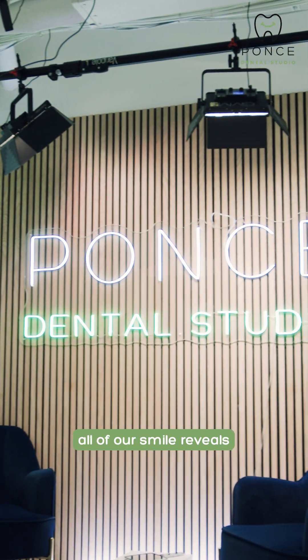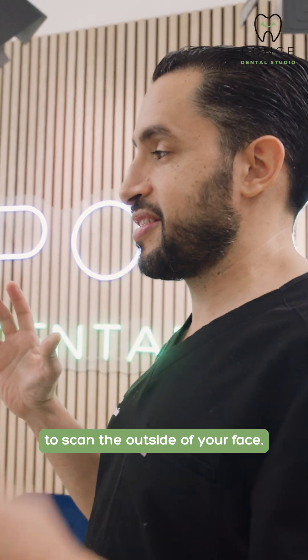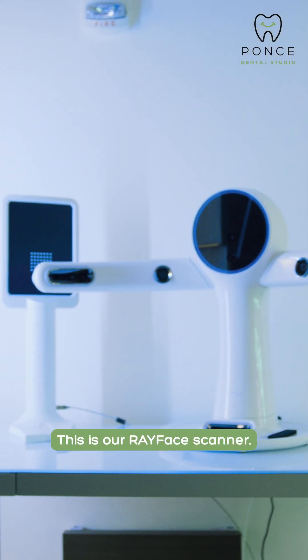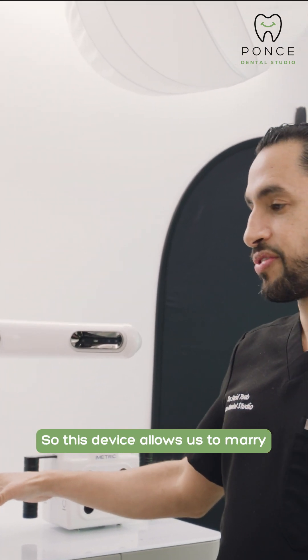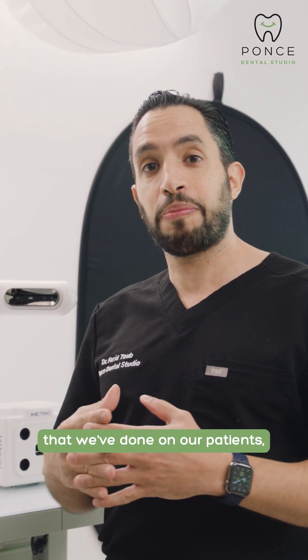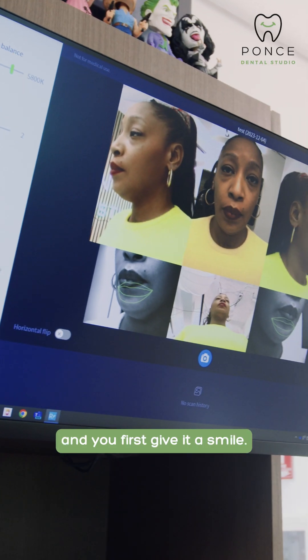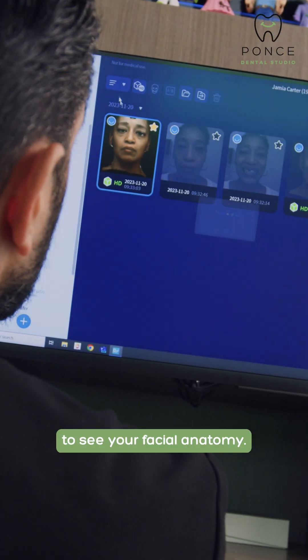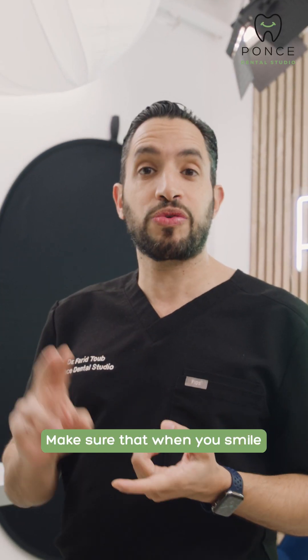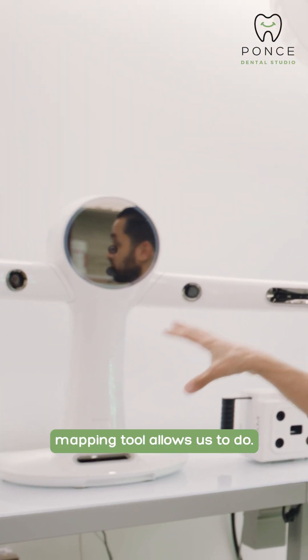Welcome to our studio room. This is where we do all of our smile reveals. We actually use this room to scan the outside of your face. This is our Ray Face scanner, which we use as a facial mapping tool. This device allows us to marry all of the scans and everything else that we've done on our patients all in one software, all on one platform. So after the CBCT and the intraoral scan, you come in here and you first give it a smile, then we want your lips at rest. That is going to allow us to see your facial anatomy, make sure that your high lip line is correct, make sure that when you smile you show enough teeth, and make sure you have no wrinkles when your prosthesis is in. That is what this facial mapping tool allows us to do.